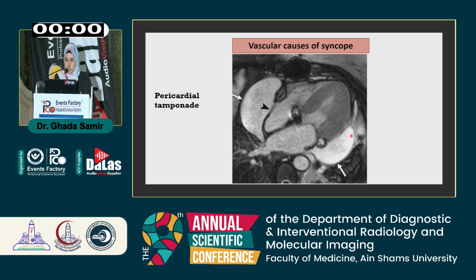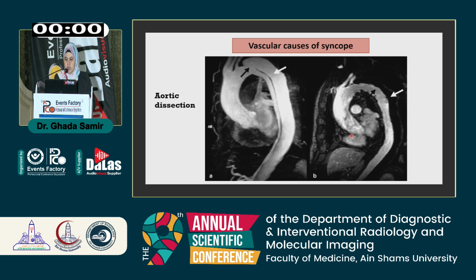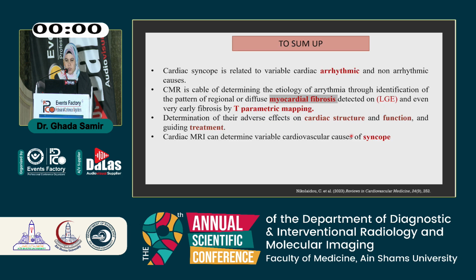Also the accumulation of pericardial fluid, which leads to decreased ventricular filling and stroke volume. And finally, aortic dissection, using gradient sequences of the MRI, may be a cause of vascular syncope.